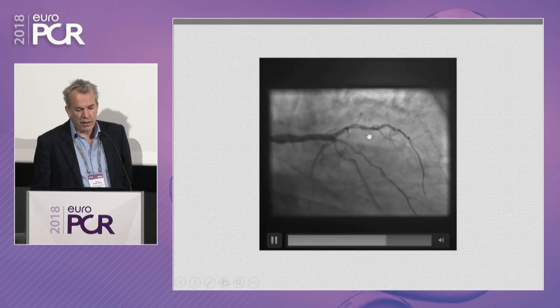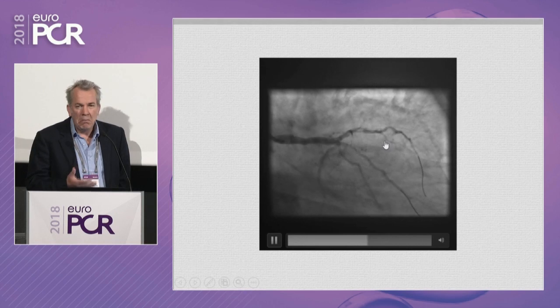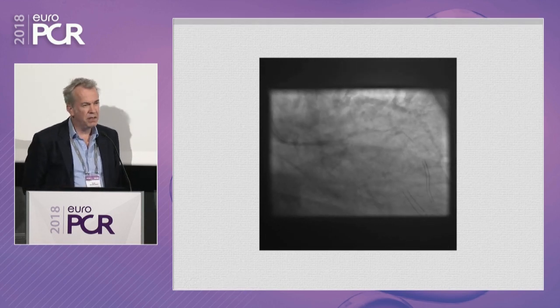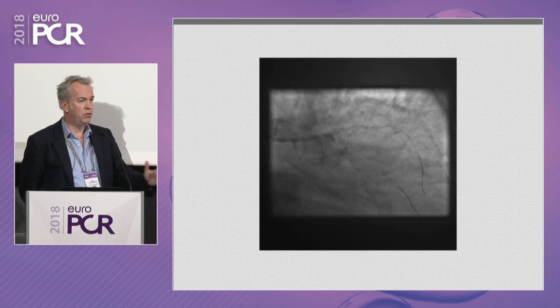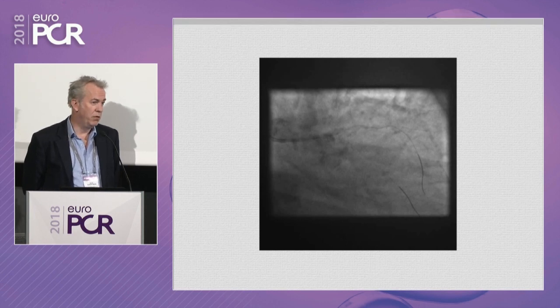I agree, it does look like they chose to leave some pretty nasty disease in the LAD, but I think on balance they took a view that the whole LAD was diffusely diseased and calcific, and maybe getting involved in that would cause trouble. The purpose of the intervention is to relieve him of his angina. And this was a year ago, in fact, and he's been fine since then. So I think, as it turned out, they took the right decision. But I take your point. Clearly the LAD is heavily diseased throughout.